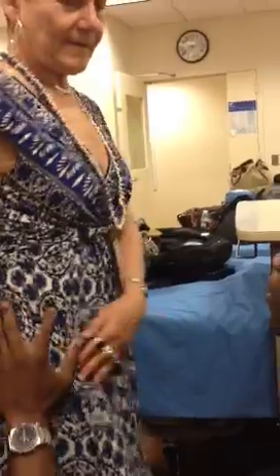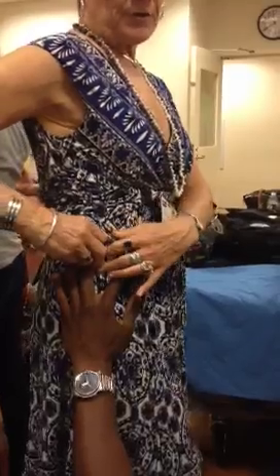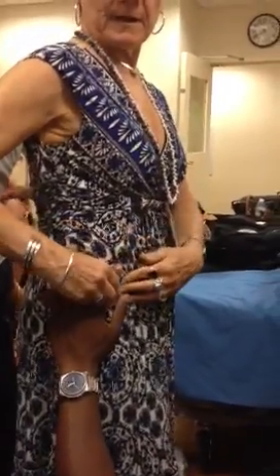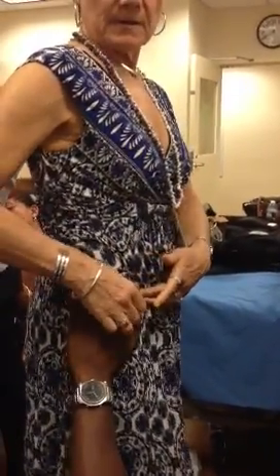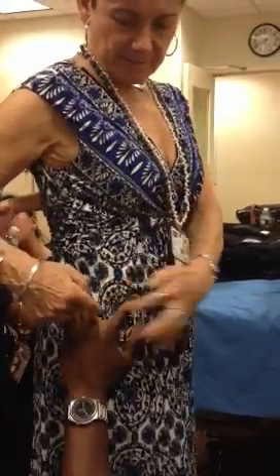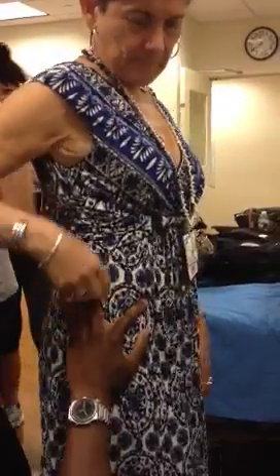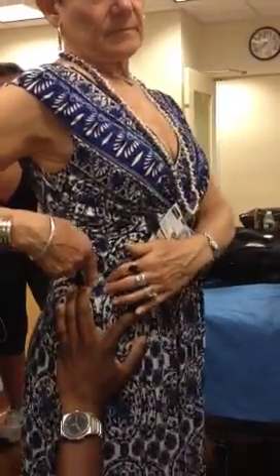And now, are you still on the trochanter? Are you too far up? Let's see. Okay, this is the trochanter. So your palm is on here. Now, this one's going to be going towards this. A lot of y'all will not be able to touch it. So go here first. So there you're going to get it right there. See, I couldn't feel the crest. There, it's very clear now.